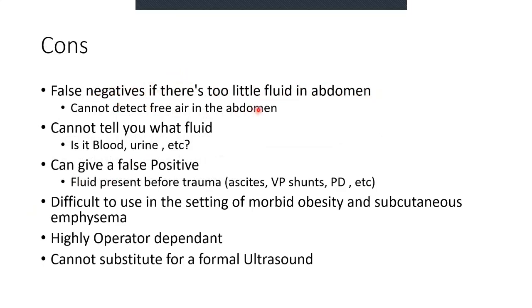It cannot detect free air in the abdomen. So you may have a peritonitic patient, EFAST comes back negative. This doesn't mean everything is fine. Do an upright chest X-ray or lateral decubitus. It will give you information as well.